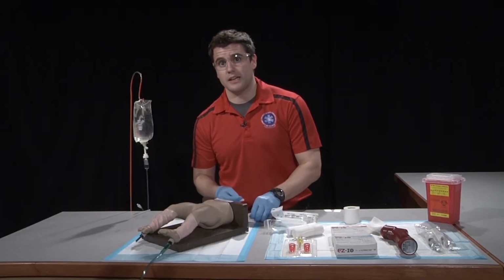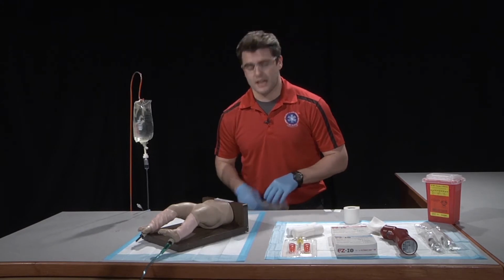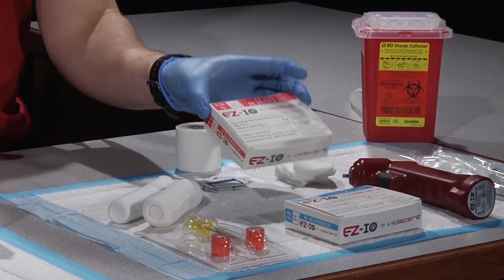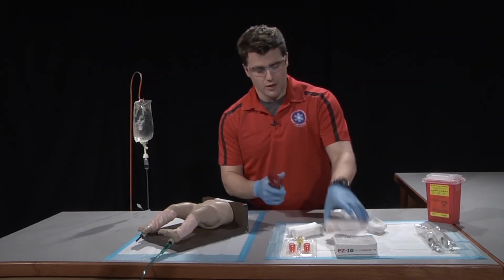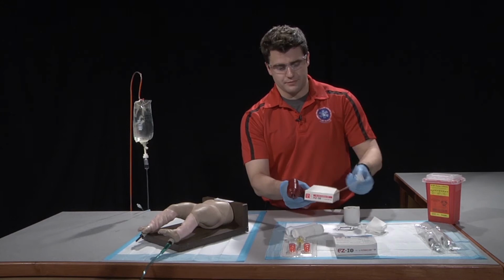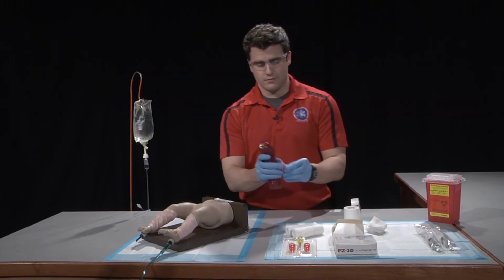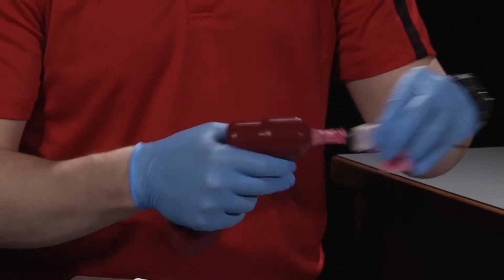Now that we've cleaned the site using aseptic technique, we're going to go ahead and choose the appropriate size needle for the IO insertion. We're going to use the pink pediatric needle. We're going to grab our insertion device, remove the needle from packaging, and we're going to inspect for burrs.